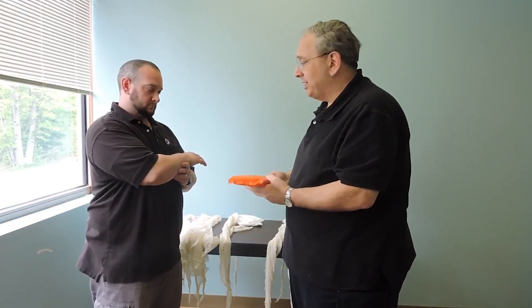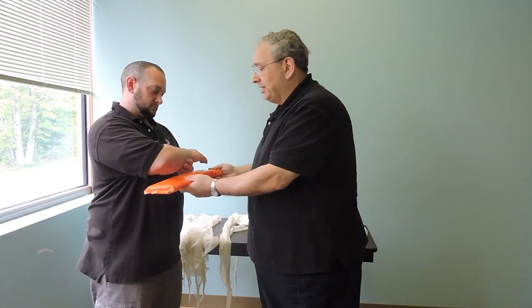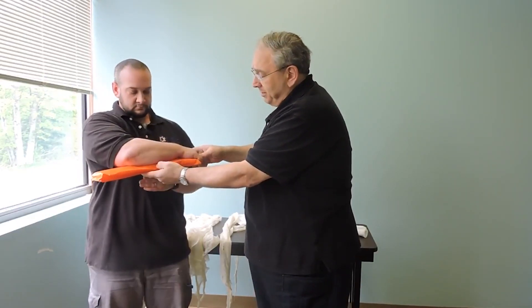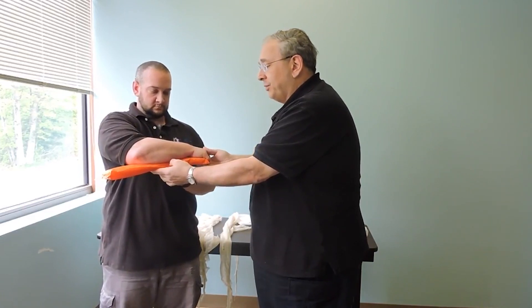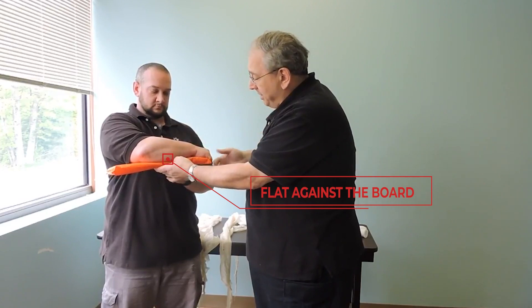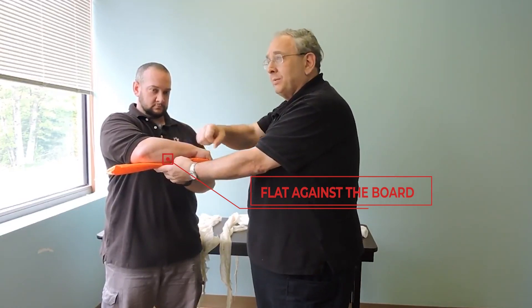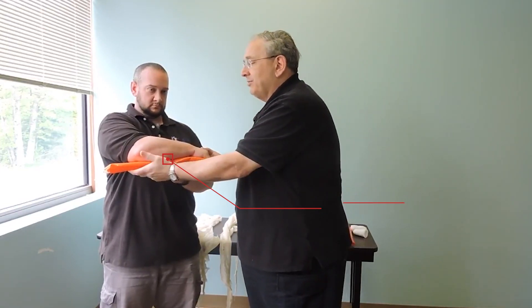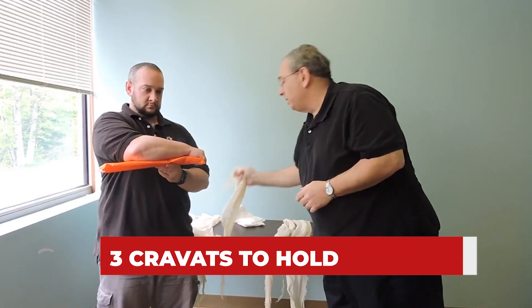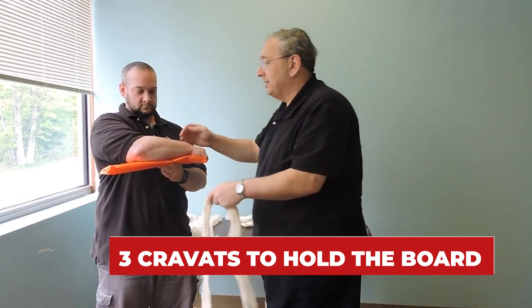My partner is holding stabilization. I'm going to come in, take this splint, and put it right under my patient's arm. I'm going to have my patient grab the end of the board. What that does is it keeps that arm flat against the board with no voids and it maintains that hand in the position of function. My partner is holding the board for me and I'm going to use three cravats to hold this board in place.